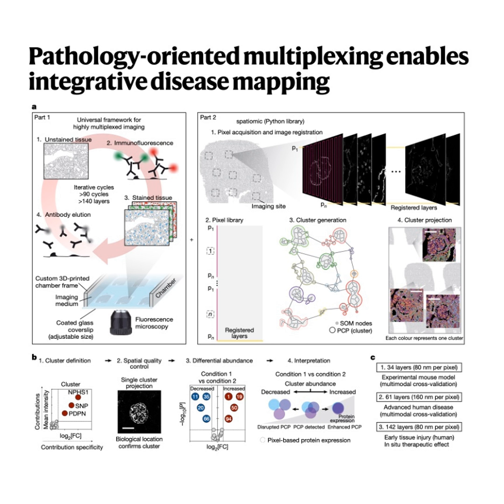And they showed it works. The tissue structure stayed intact through all 95 cycles. The elution is really, really critical. Okay, so the signal is clean, but keeping the tissue itself physically stuck to the glass slide for 95 washes and chemical treatments, that seems like another major challenge, especially with fragile biopsy samples.